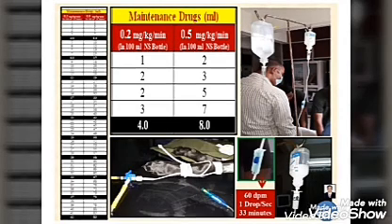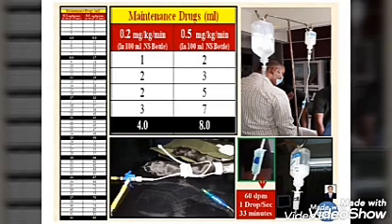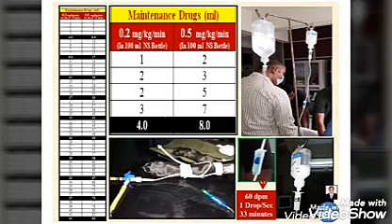So first, load the 1% propofol as per the calculated ready-made chart and body weight of the animal, and infuse it into the 100 ml normal saline bottle. So first take the 1% propofol as per the calculated body weight through the ready-made chart and infuse it into the 100 ml bottle.